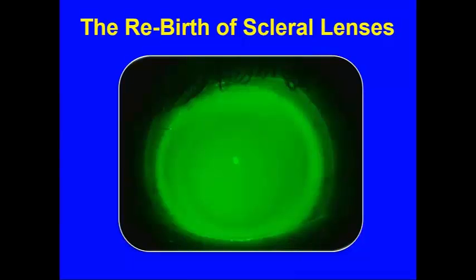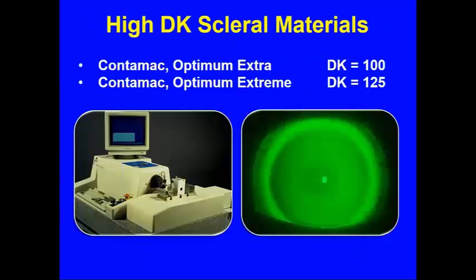Now, one question we have to ask ourselves is why the rebirth of scleral lenses? We know that these lenses have been around since the early days of contact lenses in the 1880s. Why now this sudden rebirth? Well, the rebirth has been predicated on a number of features.